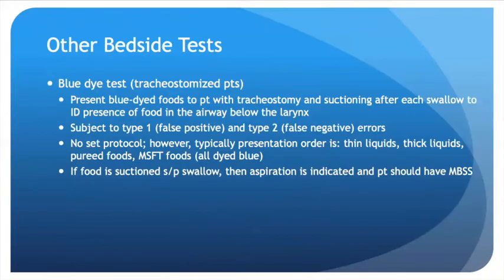There are other bedside tests that exist as well, like the blue dye test. This is performed in tracheostomized patients. So in this test, you present blue dyed foods and drinks to a patient with a tracheostomy, and then you suction through the trach after each swallow to identify the presence of food in the airway below the larynx. So if you see any blue dye that comes out through the suction tube, then you make the assumption that aspiration has occurred.